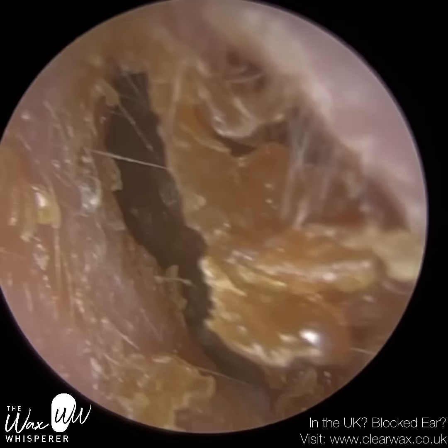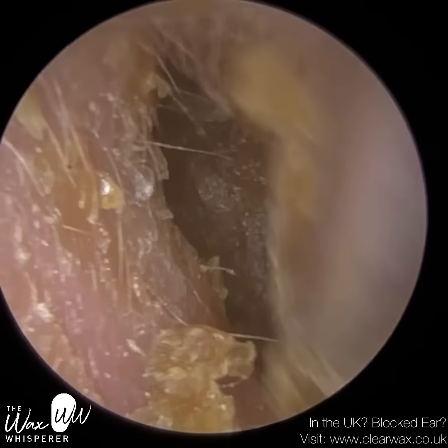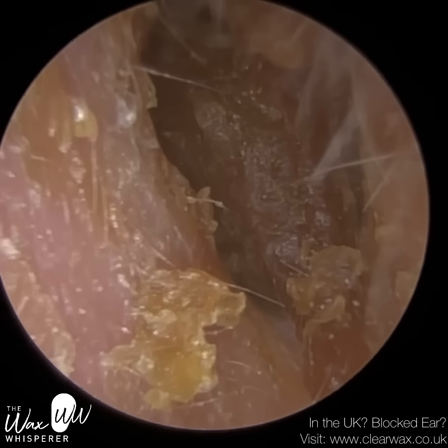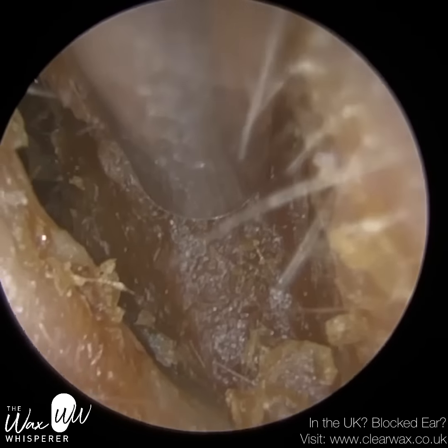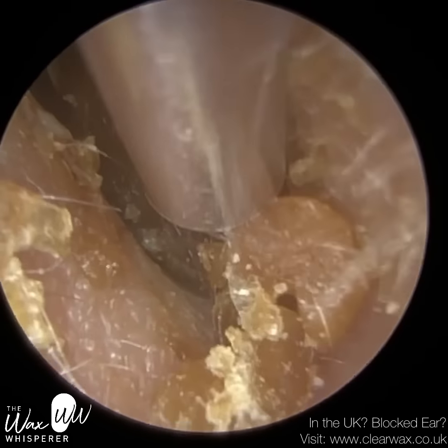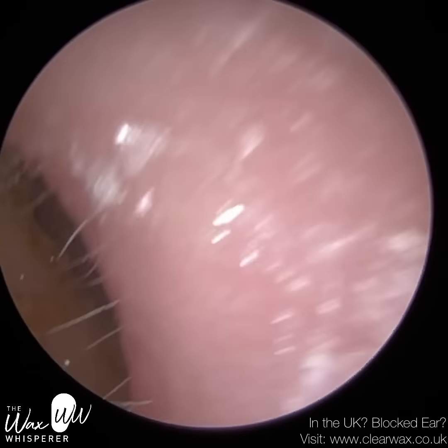They suffer from bilateral otitis externa. The term bilateral makes reference to both ears, and otitis externa is an umbrella term given to an infection and/or inflammation or itchiness of the outer ear. We're in this patient's left ear, and this really dry wax and keratin plug is not really budging with the standard suction probe, so we're performing microsuction.